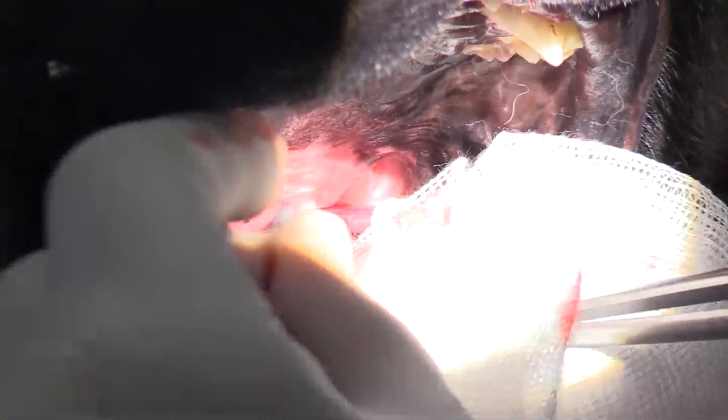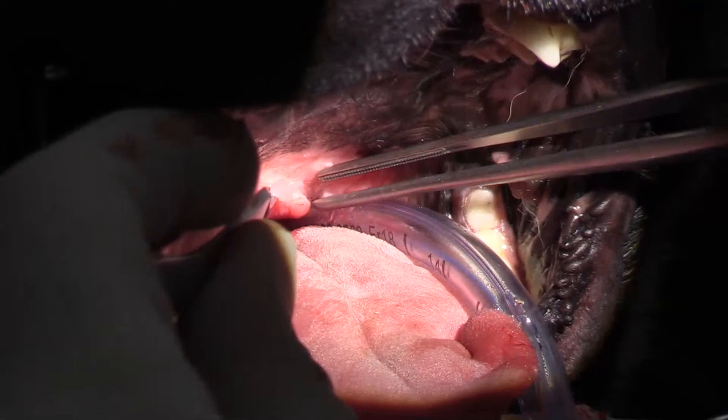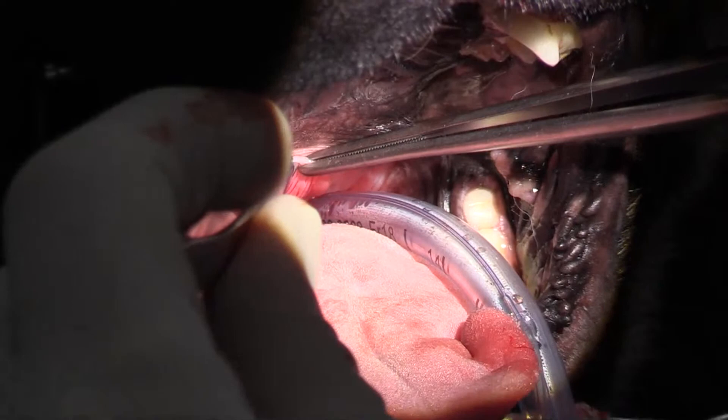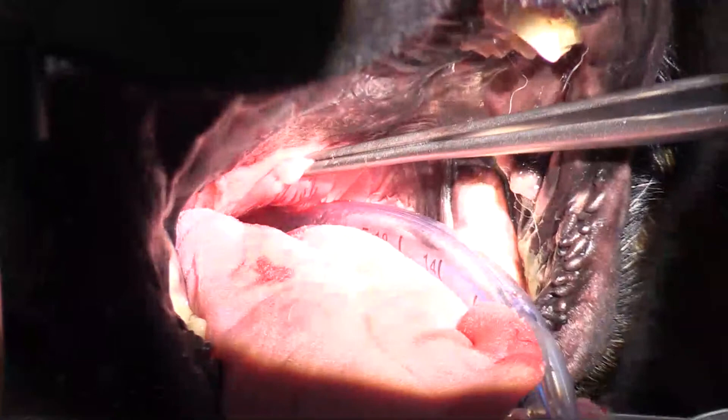I've got the soft palate here, and the first thing I'm going to do is take the caudal end of the soft palate and bring it up to the cranial extent of where it naturally wants to sit, which is just right up in here — that's almost to the transition between pigmented and non-pigmented epithelium.